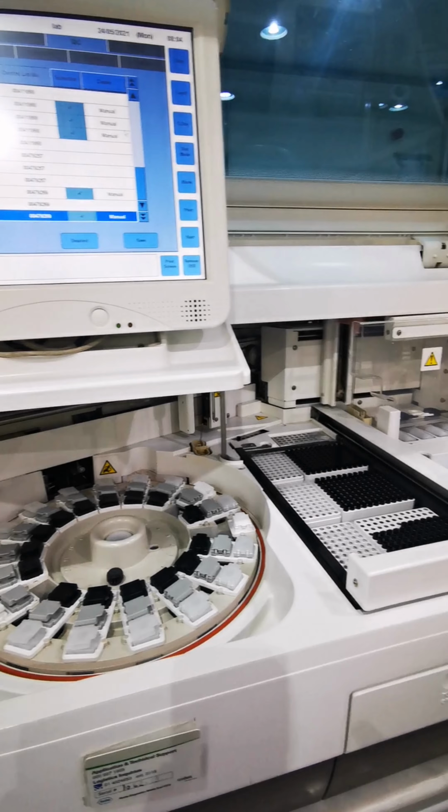Today I have two controls which are PCU2 and PCV2. I will choose PCU2, so I will assign it on the number 1 position. I also have another control which is PCV2. I will assign it on the number 2 position and then OK. Then you have to put the PCU2 control in the number 1 position and the PCV2 control on the number 2 position.